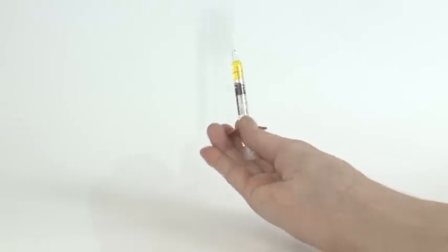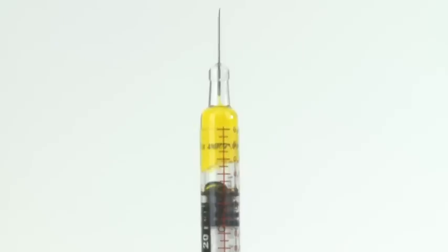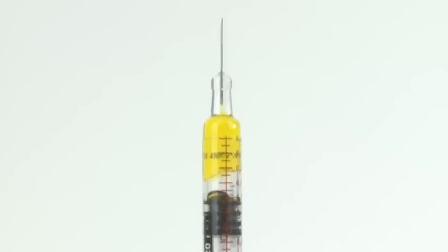Please note that there should be an air bubble in the syringe. This is to ensure all the methotrexate solution is administered during injection. Do not try to get rid of the air bubble before injection. Do not touch the sterile needle.